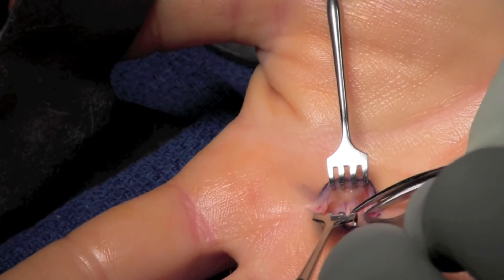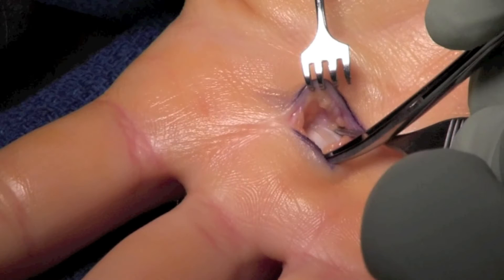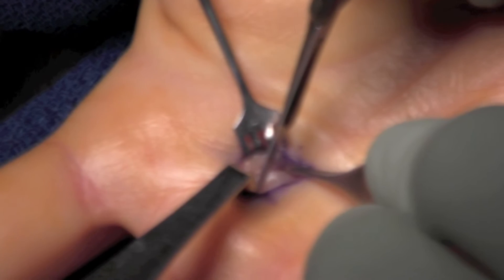We place our scissors on either side of the tendon and spread longitudinally. This allows for access — as seen here, you can see the proximal edge of the A1 pulley.